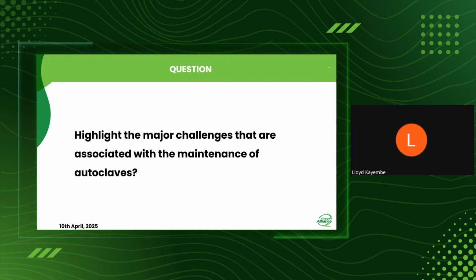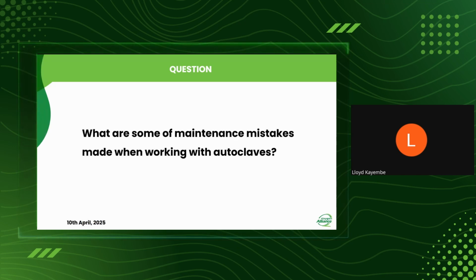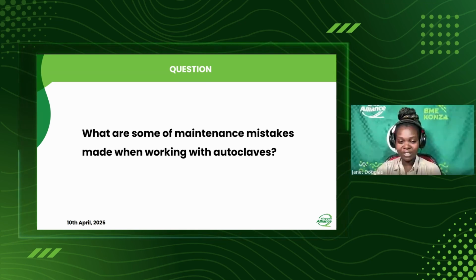Yes, Lloyd. I just want to add on what Engineer Hafra has said as well. One day we were working with the autoclaves, and we experienced the same thing. It was actually a heating element that was causing this, because it had a small burst inside the boiler, so it was shorting the whole autoclave. Whenever you touched it, you experienced a shock. So that is one of the other causes for this shocking. Thank you so much, Engineer Lloyd.